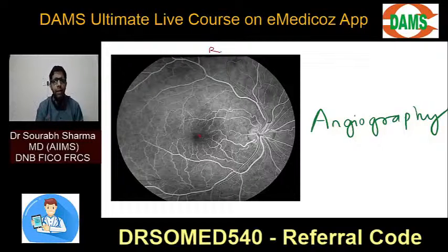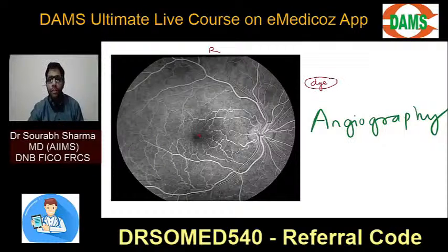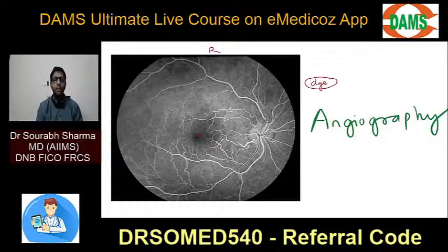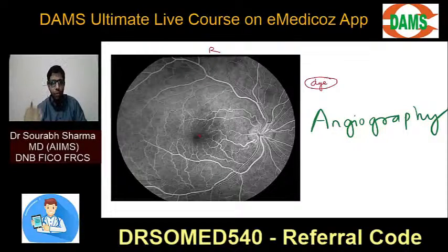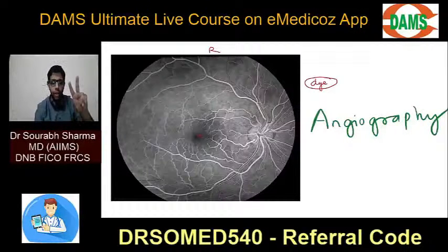Sir, why is it black and white? Why not colorful like retina? Because we put a, what is this white? White is nothing but a dye, which is put inside the retinal vessels and choroidal vessels. So this is right angiography. We have to put a dye so that it reaches the retinal vessels or choroidal vessels. The first question is, which dye to be used? Okay, we have to understand question wise. Which dye to be used? Two dyes can be used. Answer is two dyes can be used.